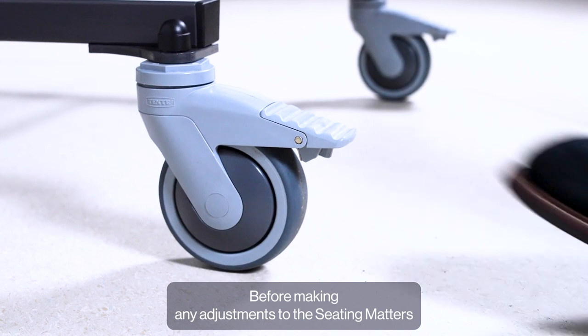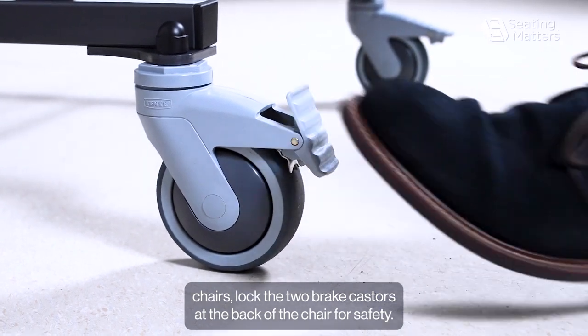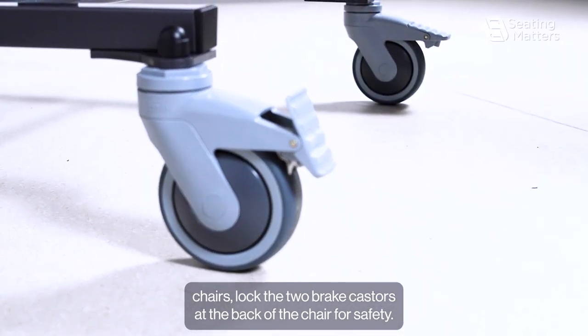Before making any adjustments to the Seatmatters chairs, lock the two brake casters at the back of the chair for safety.